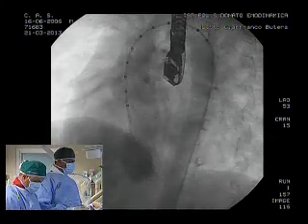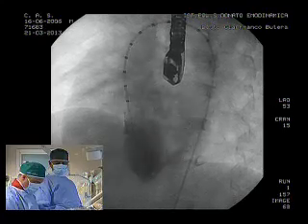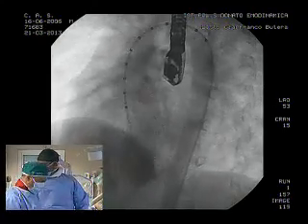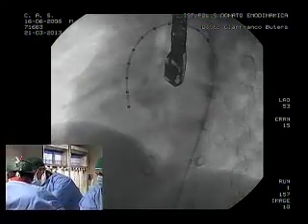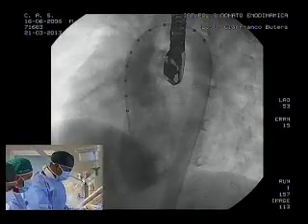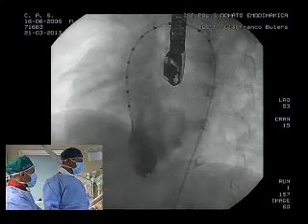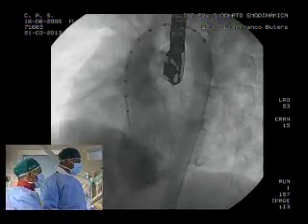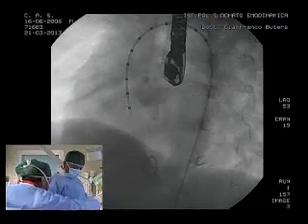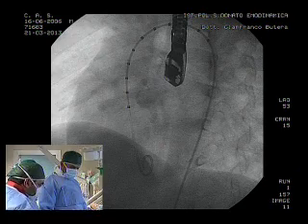If we assume, Evan, that this kid is a surgical candidate, give it a try in the cath lab. The worst that can happen is that he ends up with too much aortic insufficiency. You send him to the OR. It's the same operation. They just retrieve your device. It's not bad medicine. The other thing is, Ziad, I assume you're not having PFM coils.